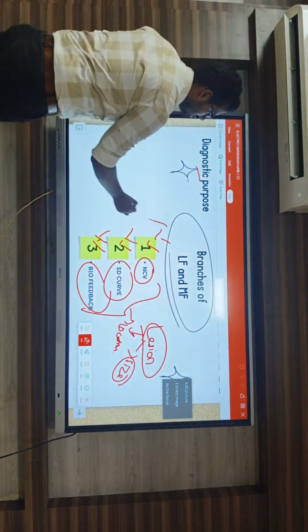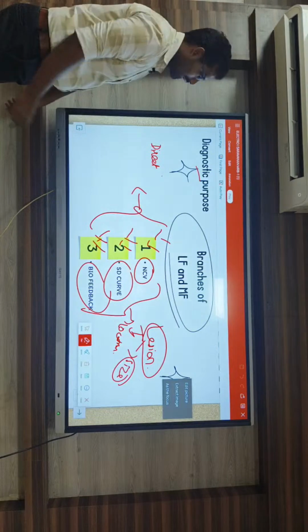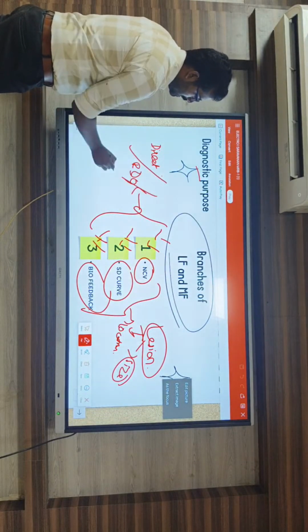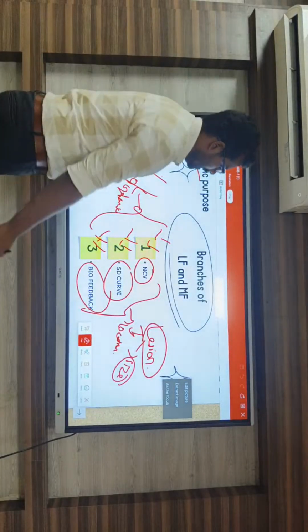Mainly in the three branches we are going to use direct current, or interrupted direct current, otherwise known as galvanic current. Okay, and next.